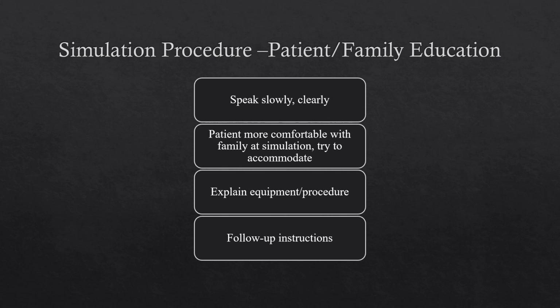Why do we have to do that? Because we saw one of the questions in the lab, where they said the most common question they ask is, why do I have to do a CT simulation? I already have done that before. Just try to explain that CT simulation is not only for diagnosis, but it's also to plan the treatment that you will use during your treatment, so the patient feels more comfortable by understanding why we do another CT during the simulation.